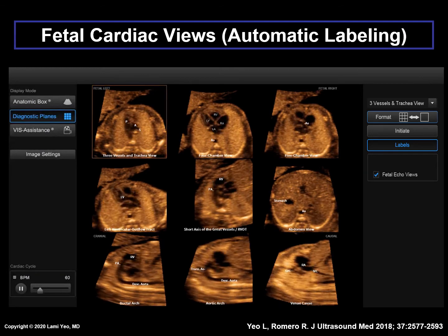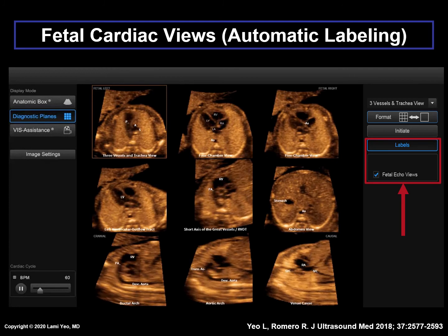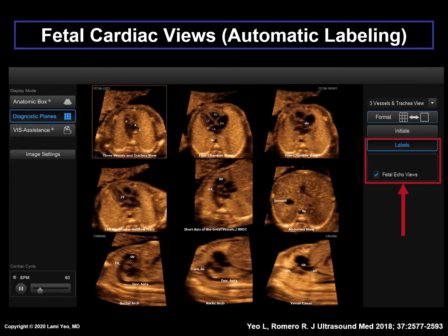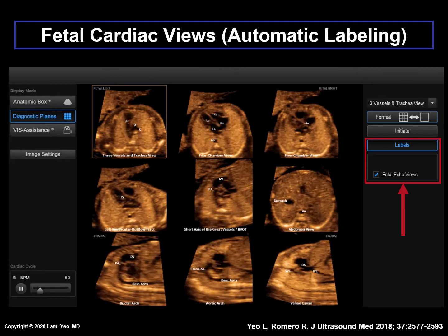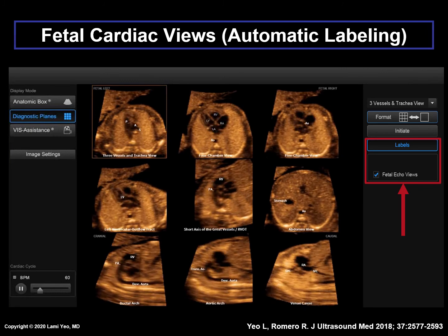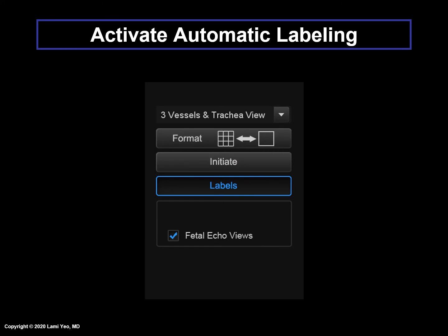To activate automatic labeling, one should press a combination of two buttons — Labels and Fetal Echo Views — as shown in the red box. In this example, all the automatic labeling has been activated, which includes all fetal cardiac views, the left and right sides of the fetus, cranial and caudal ends, as well as fetal anatomy. To achieve any of the four possible automatic labeling options, one should press a combination of these two buttons: Labels and Fetal Echo Views.